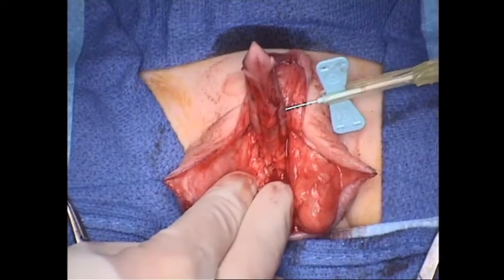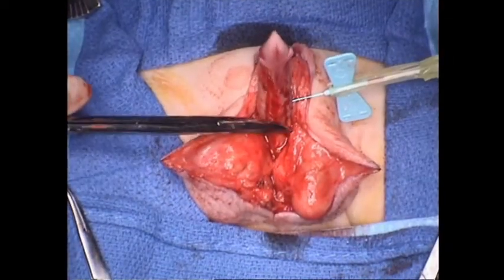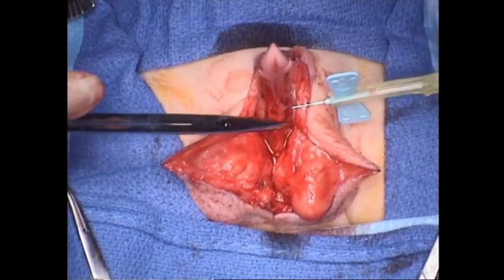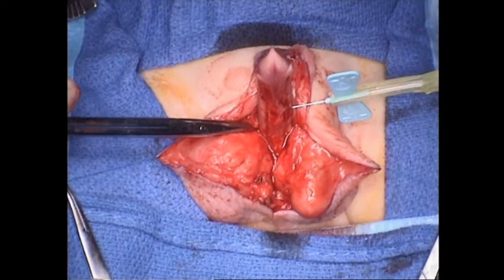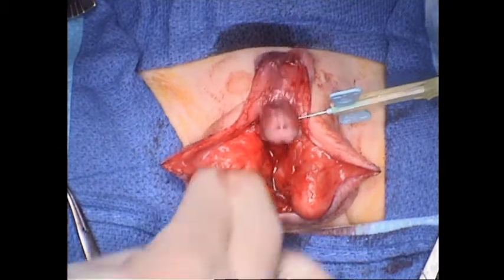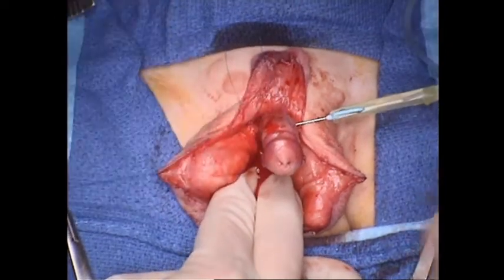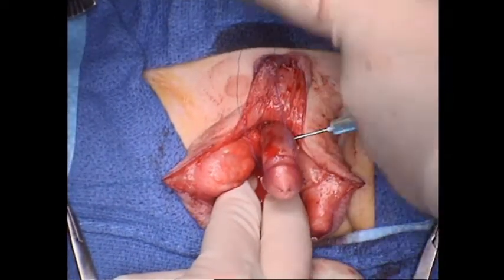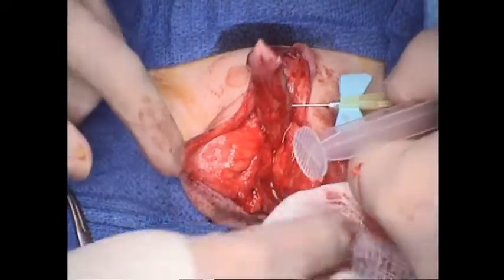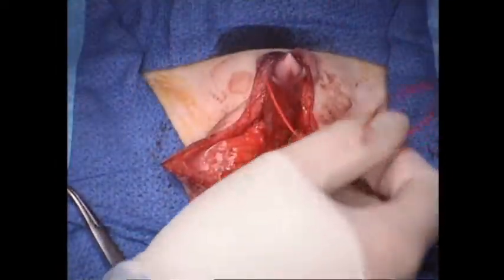Now, the first time we check the erection, we're not going to put a tourniquet on, because in patients with proximal hypospadias, sometimes the crux of the curvature can be right here at the penoscrotal junction, and you will miss the curvature if you have a tourniquet on right here. We've seen patients with problems related to that. In this patient, the curvature almost certainly is going to be out here, but it's just our protocol that the first time around, we can simply use our fingers with manual compression, goniometer. Yep, so once we've verified that the curvature is not down low, then we'll put a tourniquet on.